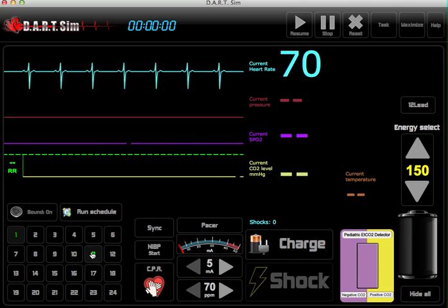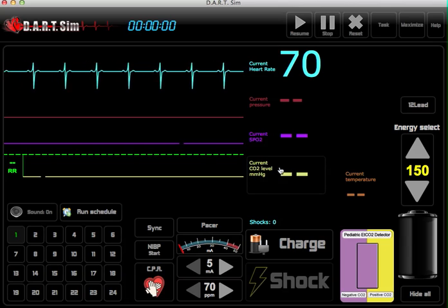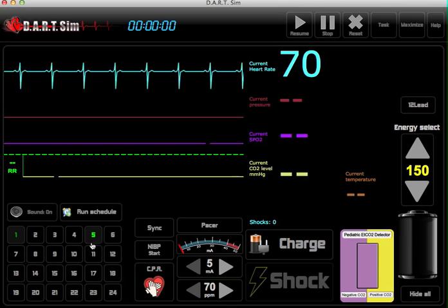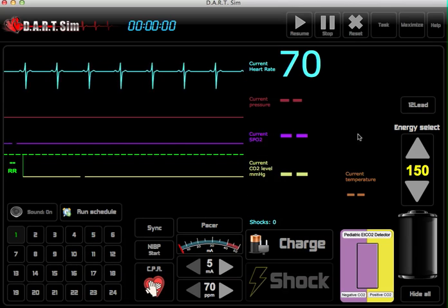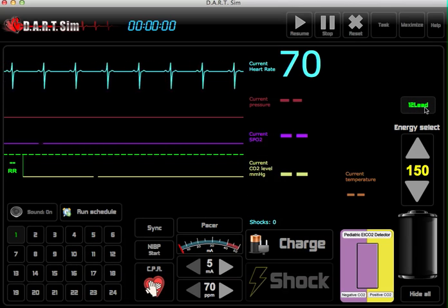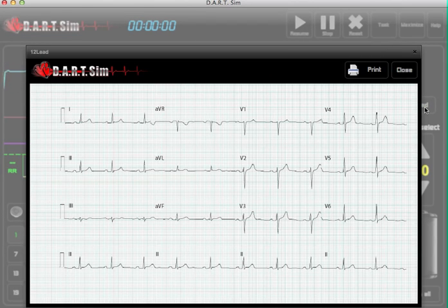We also have a 12-lead function. Whatever rhythm is being displayed, just simply tap on the 12-lead button here and it will display the 12-lead of that rhythm.